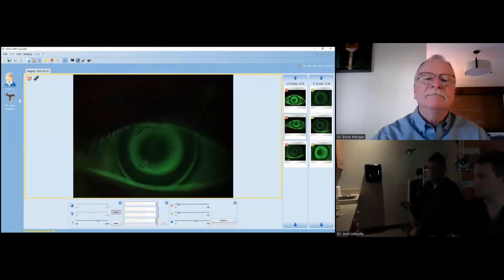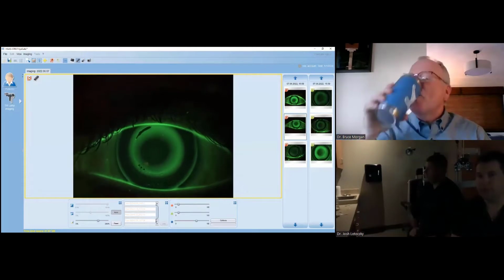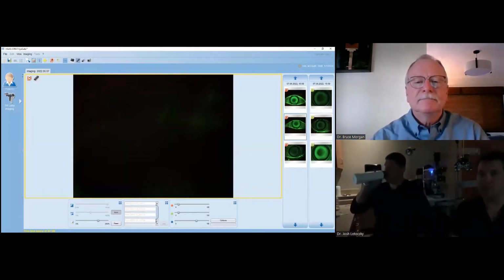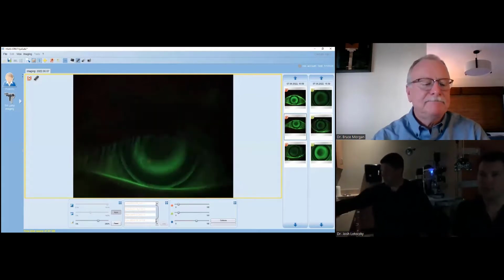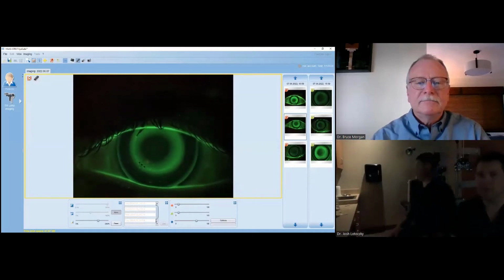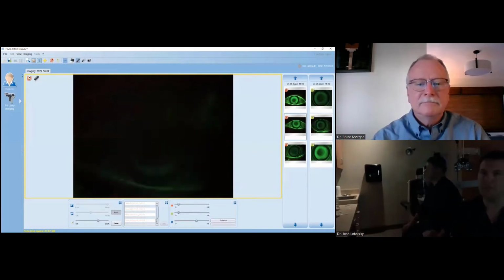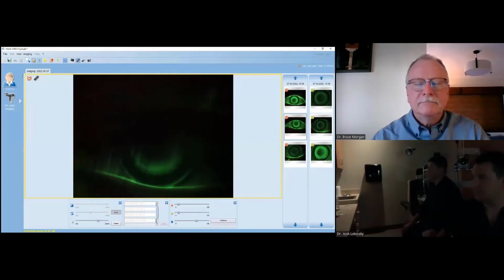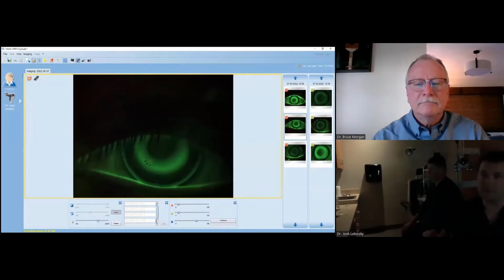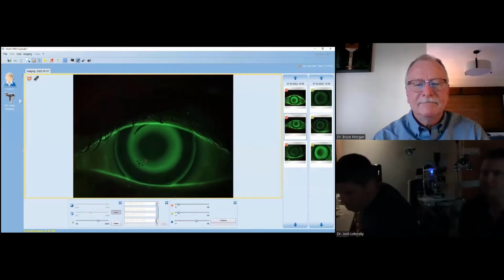So let it ride. And to your point earlier, if you give good input, you're going to get a much better starting point with your contact lens. It's amazing the difference that you can get by getting that good information and taking just a little bit extra time on that fitting visit. Because it makes it a lot easier when you're wondering, should I dispense or not? If you can get a better lens on, it makes it a heck of a lot easier to decide.